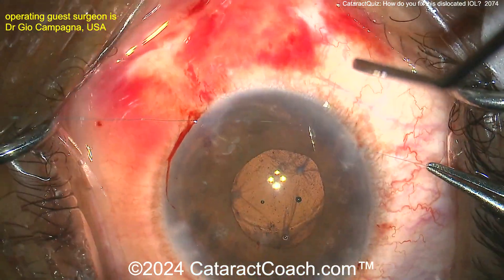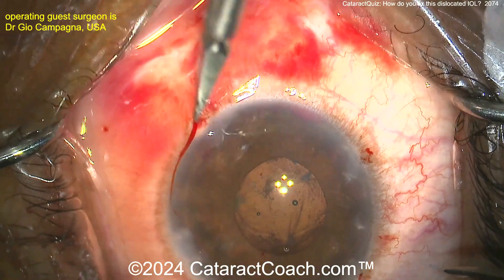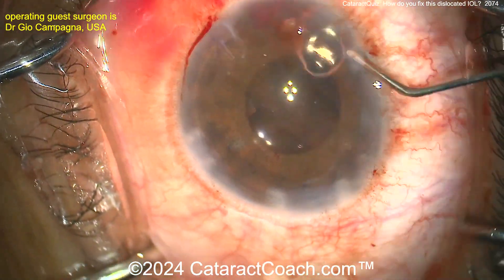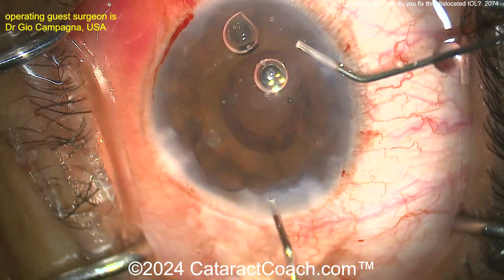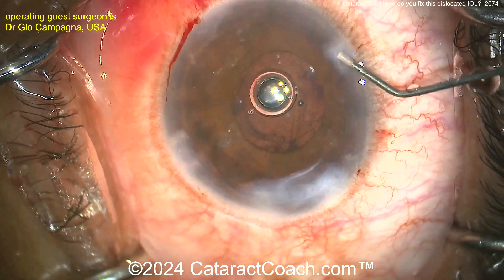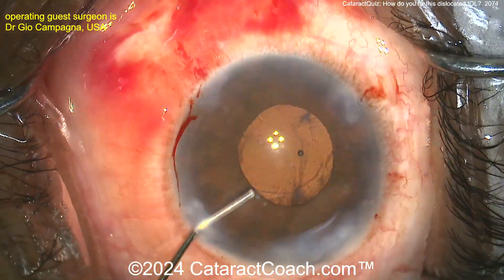Here's the end of the case — beautiful result. Tie those sutures up, cut them off, take the viscoelastic out of the eye, and call it a day. Just flush out the viscoelastic with the IA probe. You may still have some retained viscoelastic, but beautiful result — I'm sure this patient was very happy. Now you know how to suture the lens.